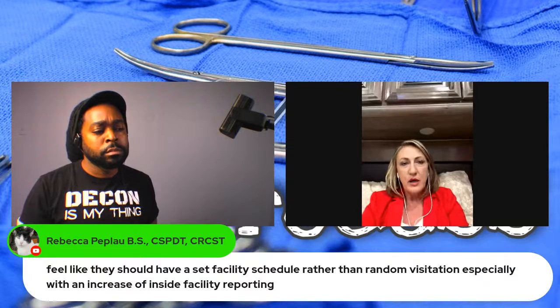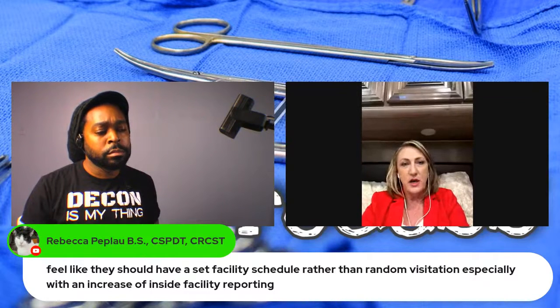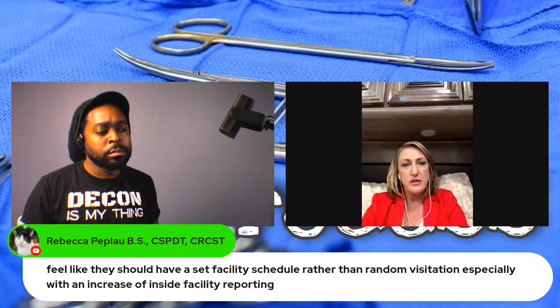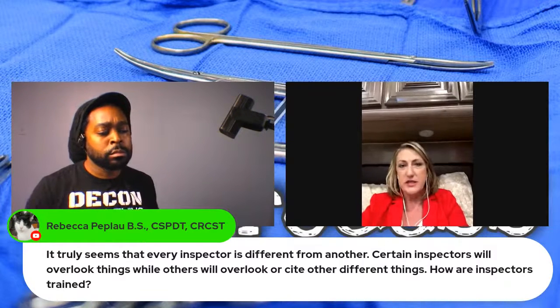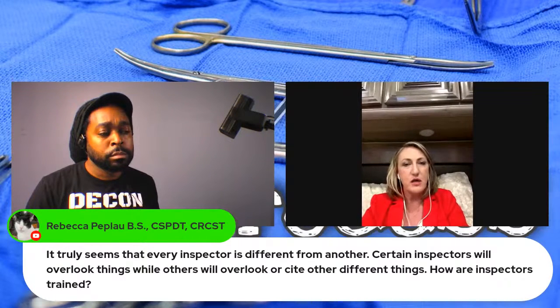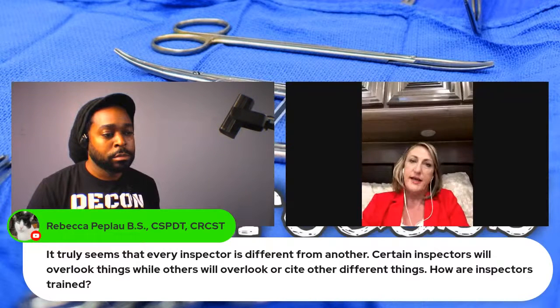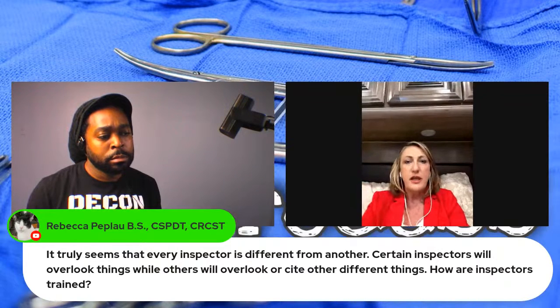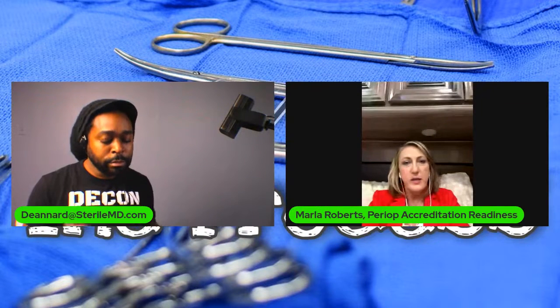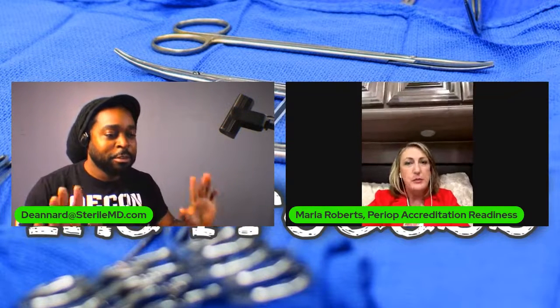As I said before, I think you should go down and work with your staff. As a VP of surgery, I would still go into the hospital and put on my scrubs and hang out in sterile processing and ask questions, answer questions, but not just answering questions, be hands-on. One hospital not long ago we were in, we pulled 600 and something peel packs off their shelves because everything was in a closed, locked position. We had to redo all of them, and sterile processing was already inundated. It was just a lack of the 3M cards that fold down to keep your instrument open. It was a lack of education and training in the department. They said, this is how I was told to do it, and so this is how they were doing it. So I think a lot of times you just got to step in and hold up.